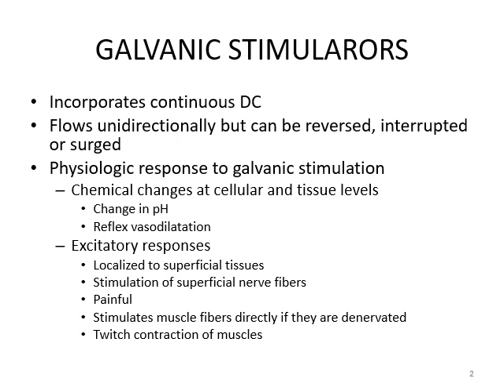If the intensity is strong enough and the duration is long enough, the galvanic stimulation may elicit a muscle contraction. The denervated muscle fibers are more easily excitable under the effect of galvanic stimulation. The usual response in this type of stimulation of muscle contraction is twitch type muscle contraction, that is sudden muscle contraction followed by sudden relaxation.